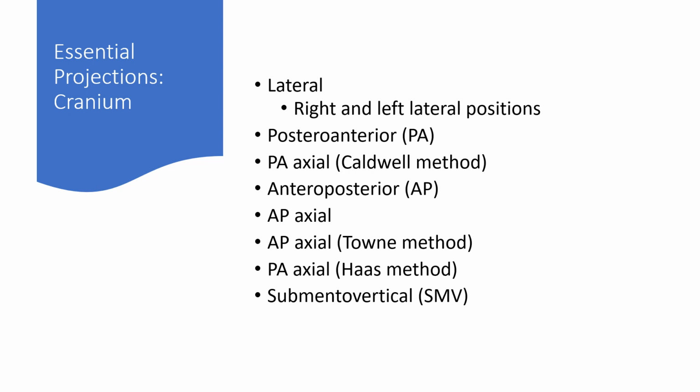Understand that most of the time when you're x-raying the skull, it's as a result of a fist fight or an assault in a trauma situation. And so they might have different injuries to the right side of their skull versus the left side of their skull. When will those injuries show up? When OID is reduced. So you get sharper edges. The edge blur reduces with reduced OID.